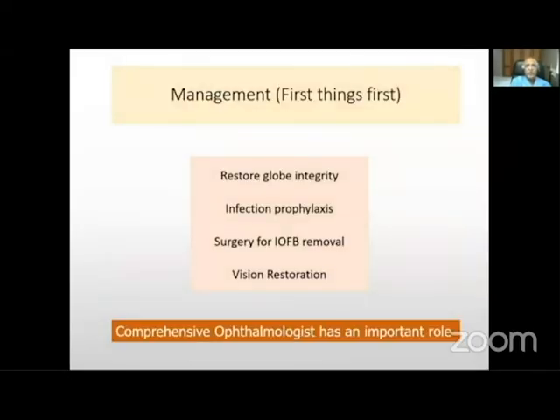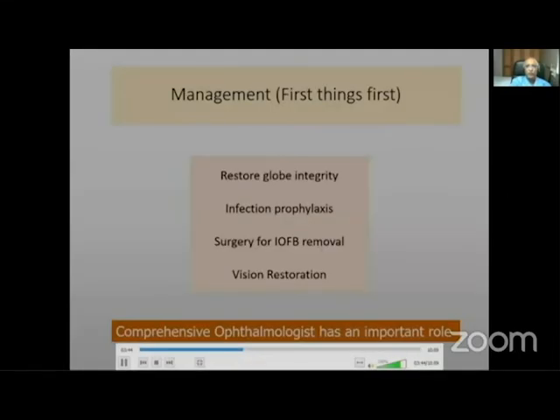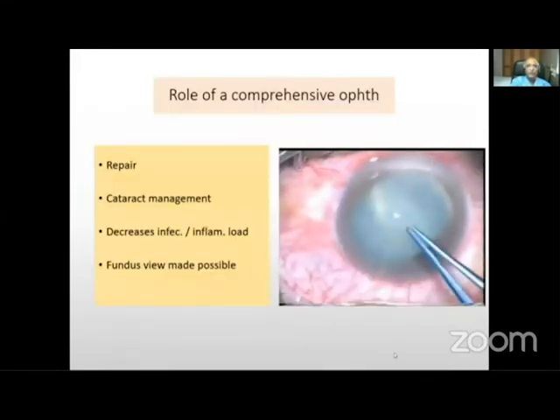So the management: restore the globe integrity, and infection prophylaxis is something that we have to observe. And then the surgery for removal of the foreign body and vision restoration. The comprehensive ophthalmologist has an important role to play. Let us see one example.